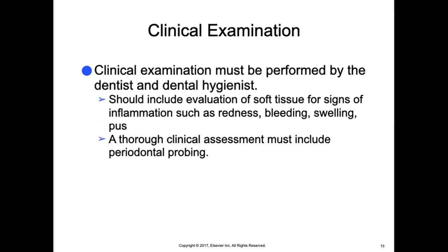The clinical examination must be performed either by the dentist or the dental hygienist. It should include an evaluation of the soft tissue for signs of inflammation, such as redness, bleeding, swelling, or even pus. A thorough clinical assessment must include periodontal probing. So whenever clinical evidence of periodontal disease is present, images must be exposed to obtain maximum diagnostic information.